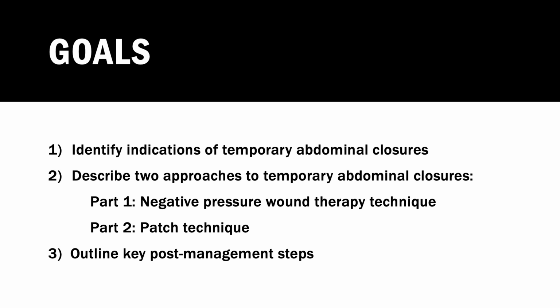The goals of this video are to identify indications of temporary abdominal closures, to describe two approaches to temporary abdominal closures, a negative pressure wound therapy technique and a patch technique, and to outline key post-management steps.